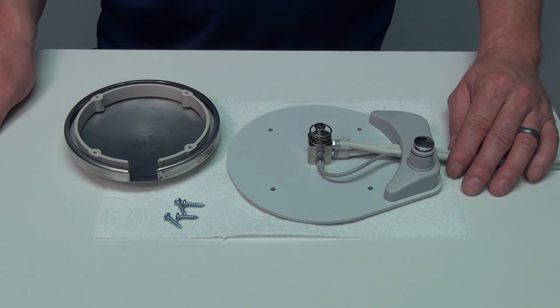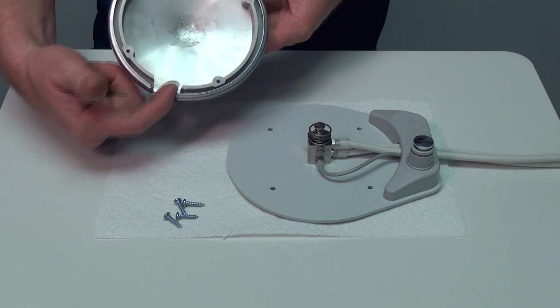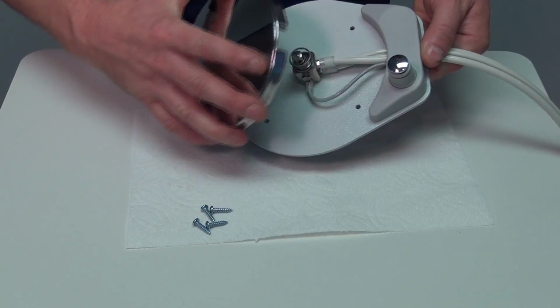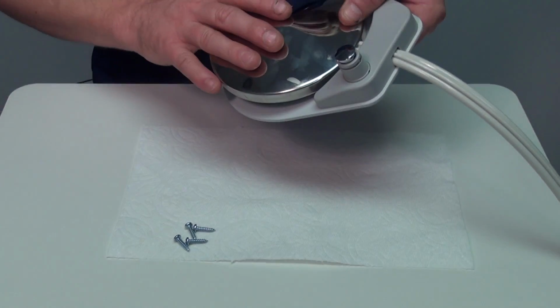Lastly, we need to mount the foot control plate back to the foot control. When doing that, there's a center slot that needs to sit over the tubings without pinching them.